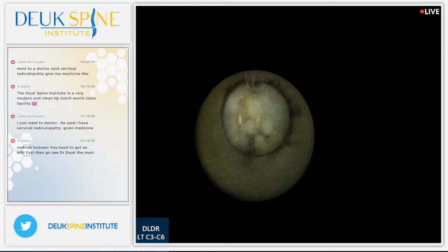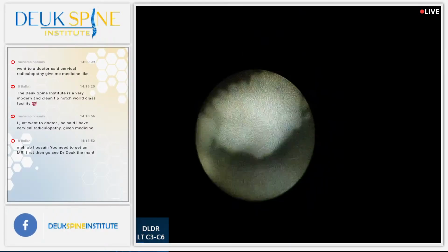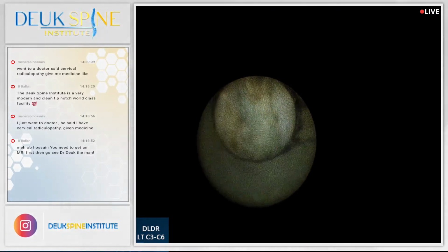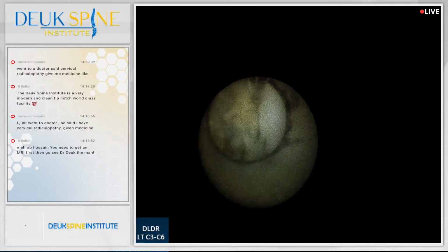It's better when I hit it with a laser like this and then it's gone. That's when it's better. Do you understand what I'm saying? All this is herniation. Look at that. When I hit it with a laser and it doesn't do anything, that's when it's not enough power. You following me, Nikki?